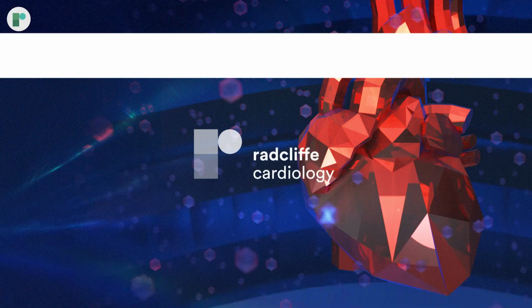What we think this means in the long term is that we reduce the long-term risk of complications of stenting by using a bioadaptor. And that means that patients will not suffer from long-term complication risks by having a stent placed in their coronaries. If they get a bioadaptor, hopefully we see a plateauing of events and nearly no long-term risks. Yeah, what is mostly needed is long-term data.